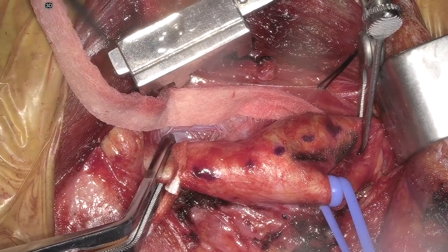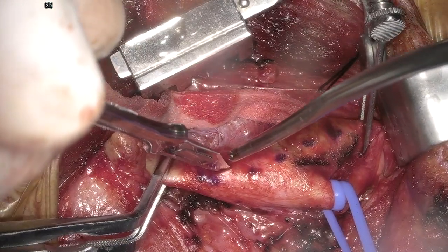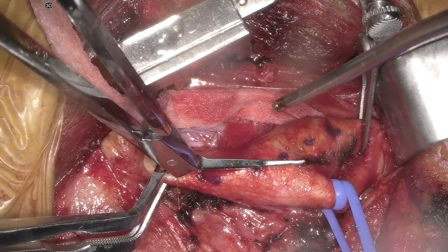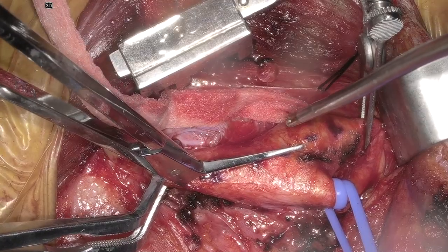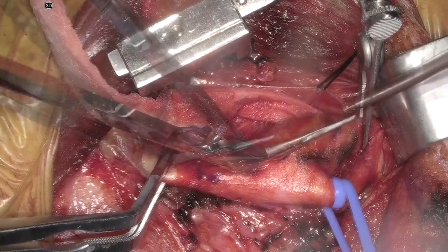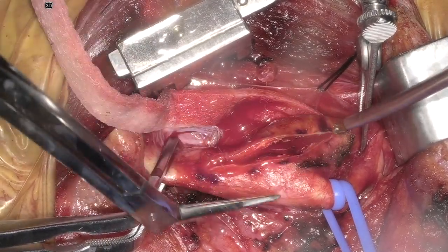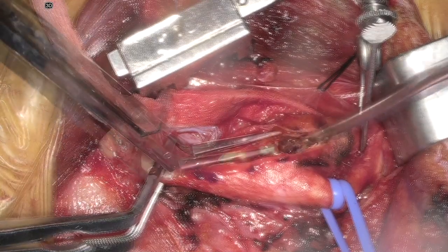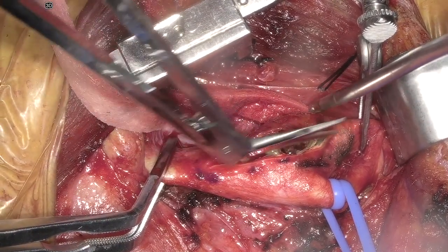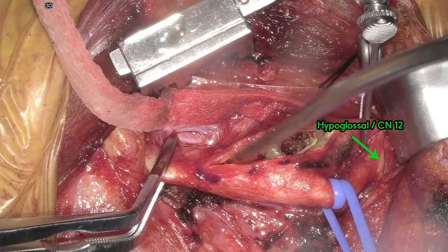We made an arteriotomy with a number 11 blade and extended the arteriotomy into the internal carotid artery using Potts scissors. Immediately you can start to see this ulcerated plaque just beyond the bifurcation.